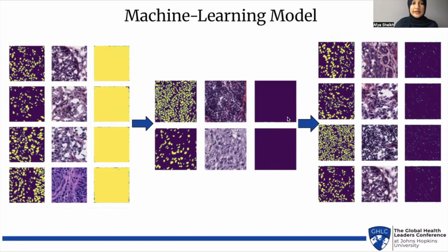So this slide just gives you a basic idea of the behind the scenes of making a machine learning model. If you can see on the left image, it's completely yellow. So the machine learning model thought the whole thing was just cancer. Not good. So I decided to split my images into quarters, which would help the model learn better. After that, in the middle image, you can see that it just thought everything was healthy. Still not good, but after running the epochs, or cycles, more, the far right image is what it started to learn. So it shows these little tiny dots, which is showing you that the machine learning model is finally able to identify a little bit of what and where the cancer might be and what it looks like. So this was really exciting for me to see.